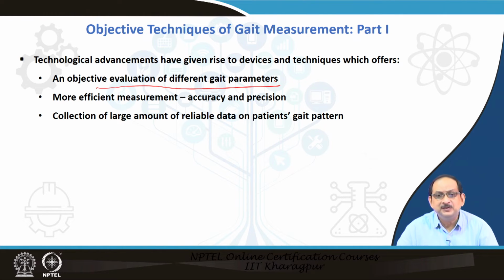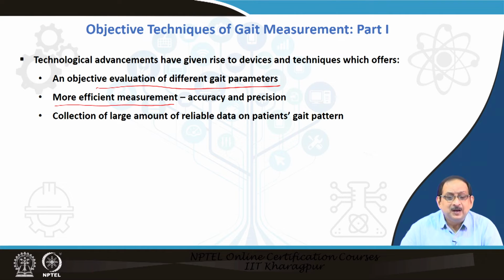The gait parameters have been discussed earlier in the lectures on gait cycle and gait analysis. These techniques are more efficient in terms of measurement accuracy and precision.